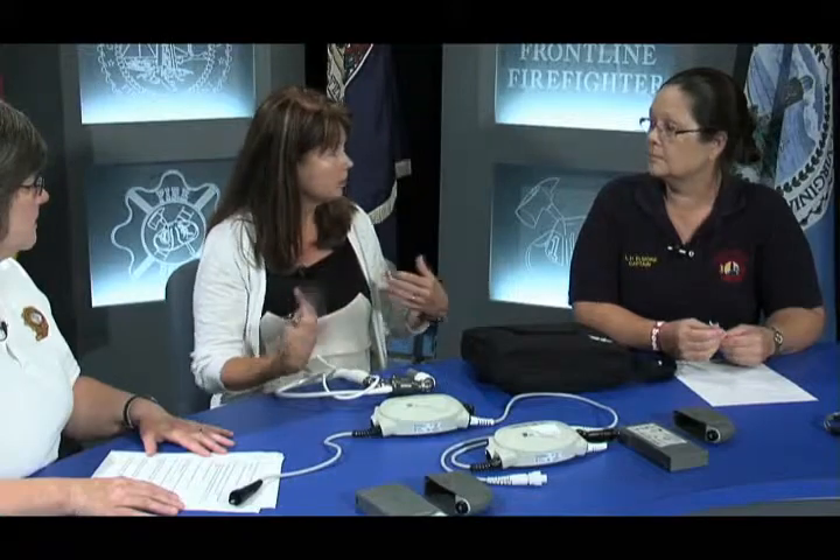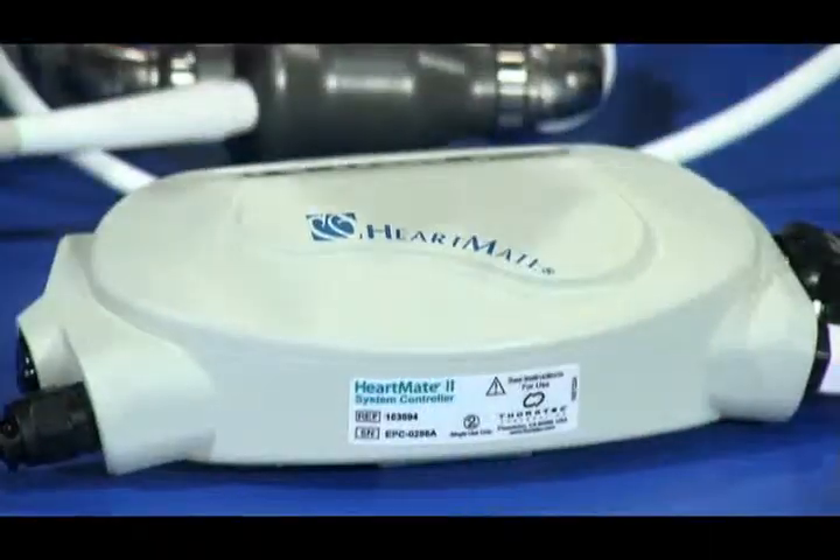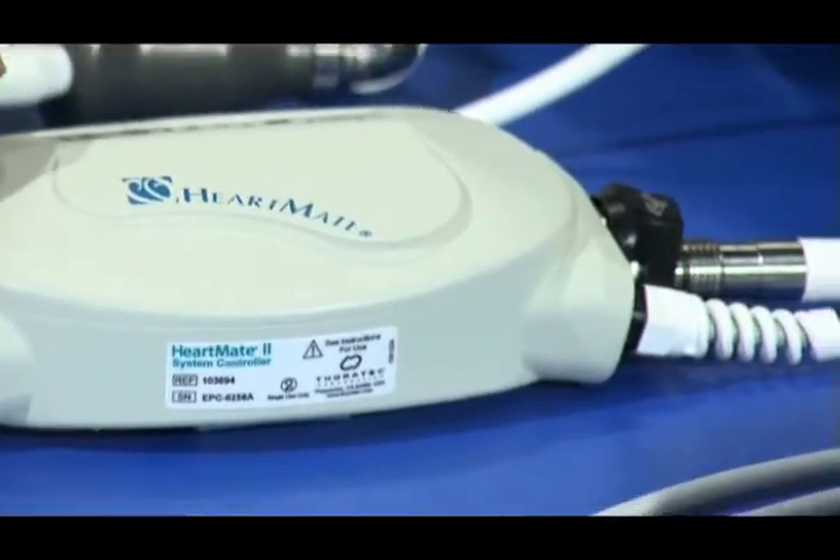Position your EKG leads so that they're not over the pump. Also, do not disconnect anything — do not disconnect the driveline, the batteries, or if hooked to the power base unit, do not disconnect electrical power in order to perform defibrillation or cardioversion. Because disconnecting power effectively stops the heart from pumping.